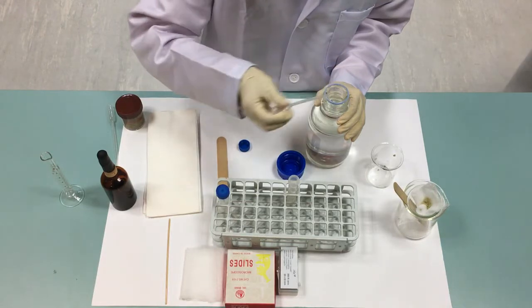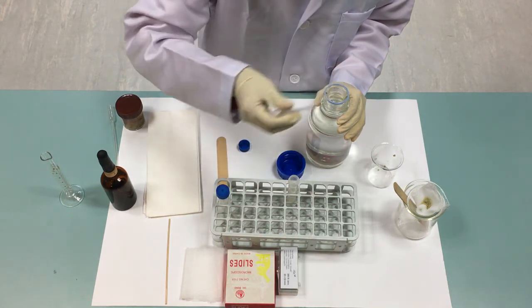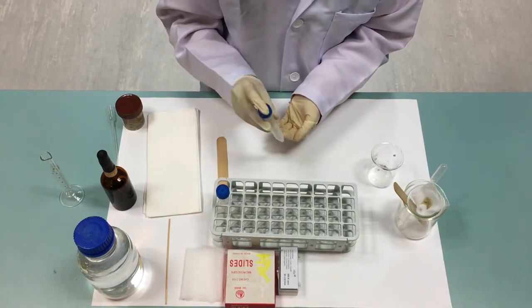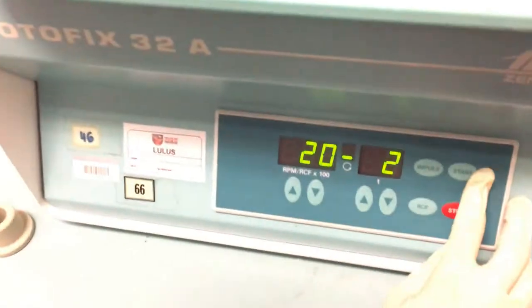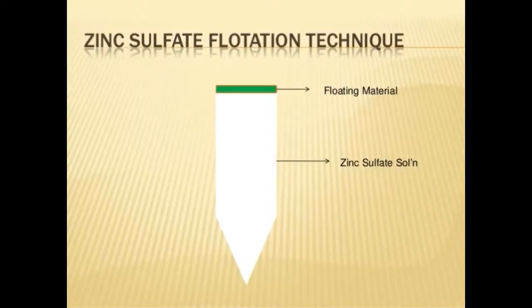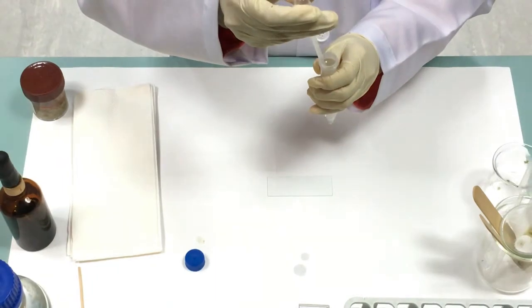Fill the centrifuge tube with zinc sulfate until it reaches the maximum volume of the tube. Mix the content in the tube and centrifuge it for 2 minutes at 2000 rpm. Without shaking the tube, take 1 drop from the solution surface and add it onto a slide.